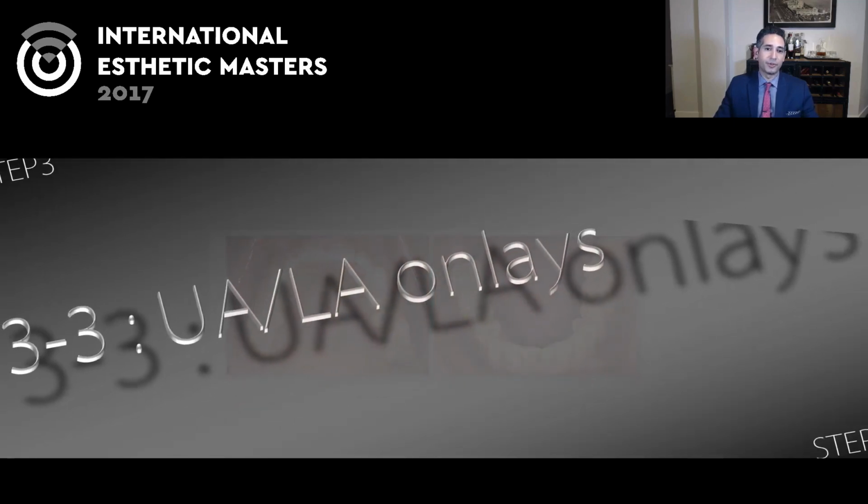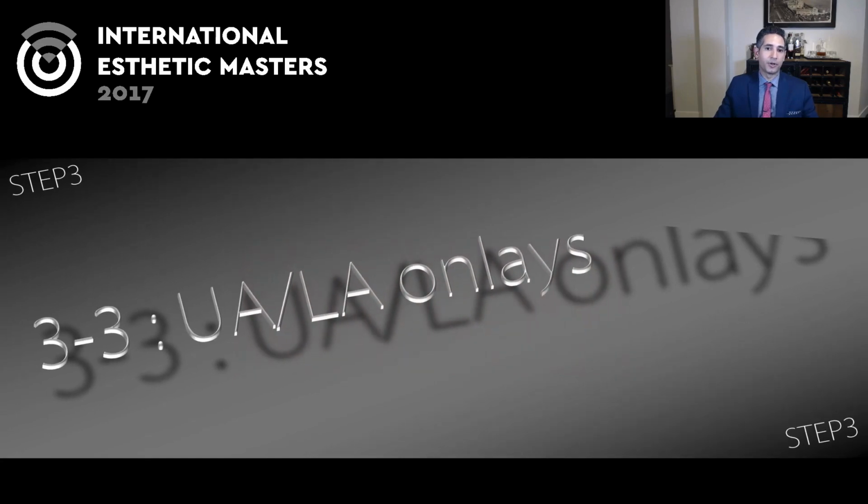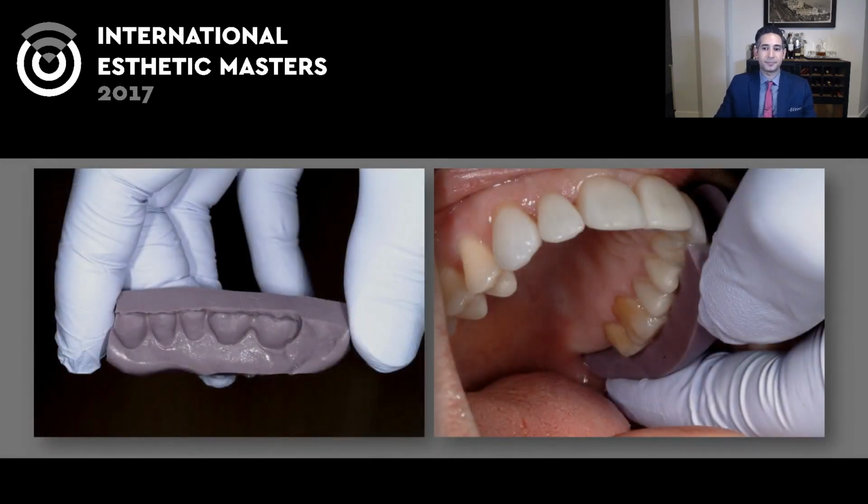So now I will do upper arch or lower arch or right side or left side. I usually like to do right left to maintain the vertical, so I'll do the right side, finish that off, either 2 quadrants or 1 quadrant at a time. I like to do 1 quadrant a lot of the times. One appointment, finish 1 quadrant, move on, and it's just a great way to proceed.